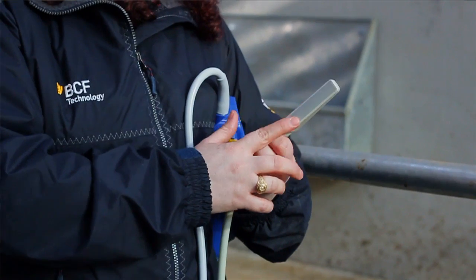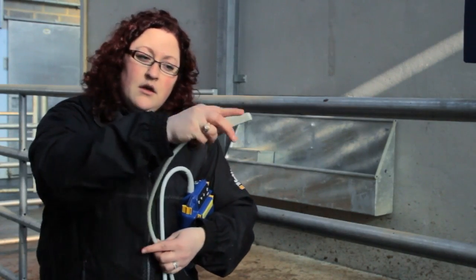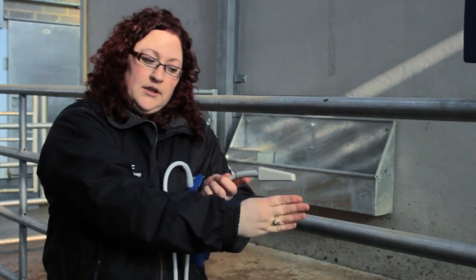The orientation of these crystals means that when the electricity hits them and they vibrate, the ultrasound wave comes down in a line.